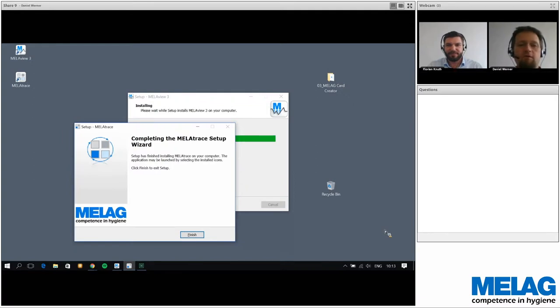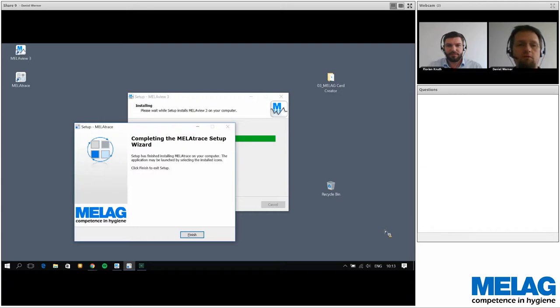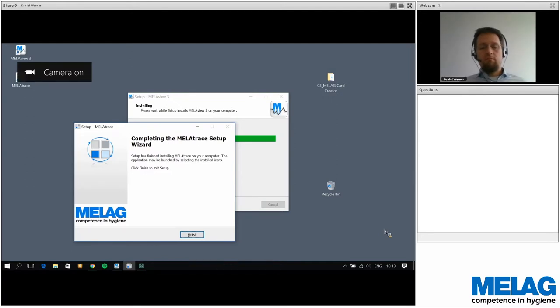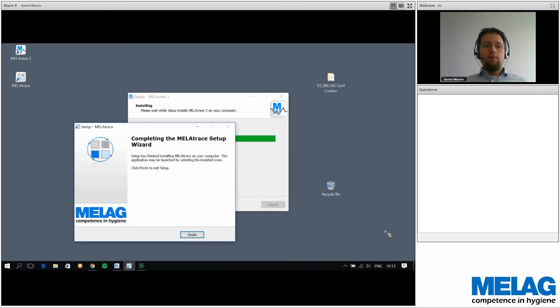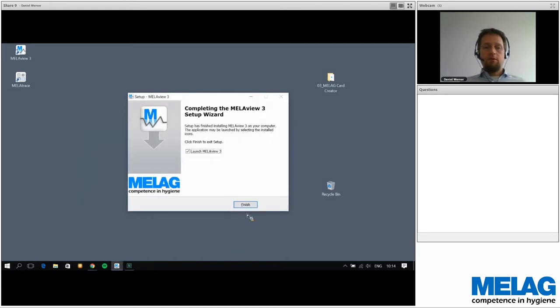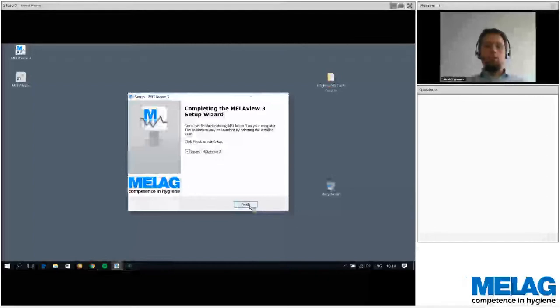Thank you, Florian. We're now on Daniel's desktop. The installation of both MelaView 3 and MelaTrace has already been completed. You can see the successful installation window for MelaView 3 and the setup window for MelaTrace in the foreground. After clicking Finish on both, MelaView 3 starts up.